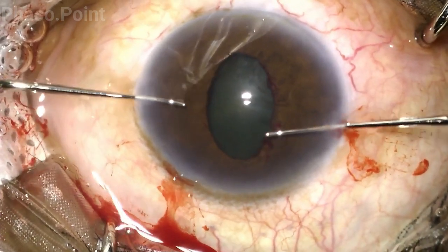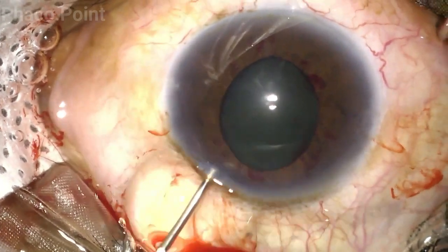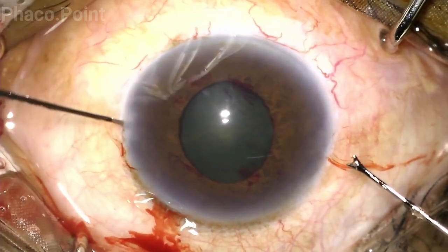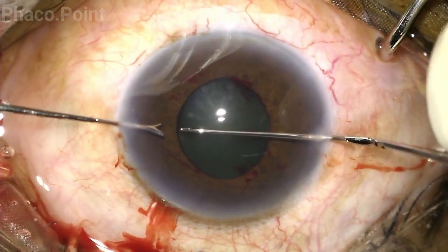Let's now evaluate what was the eventual pupillary dilatation achieved. The pupil is now approximately 5 by 4 millimeters, which is not bad but not adequate. So the surgeon chooses to do another stretch. We'll shortly see the resultant pupillary dilatation after the second stretch.